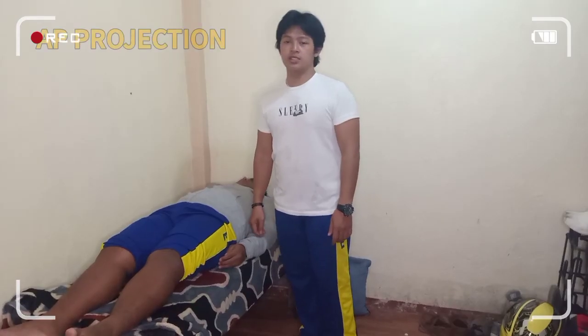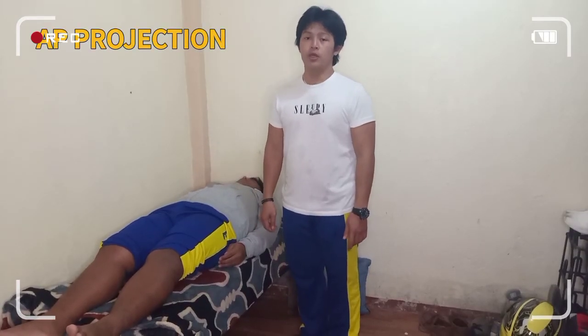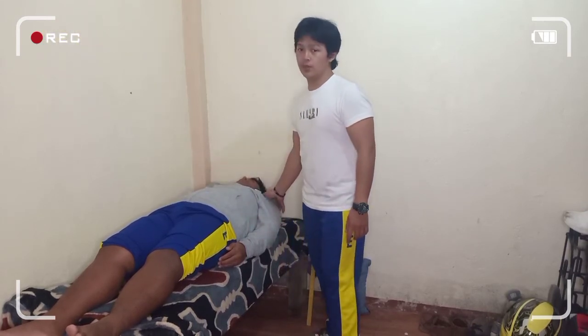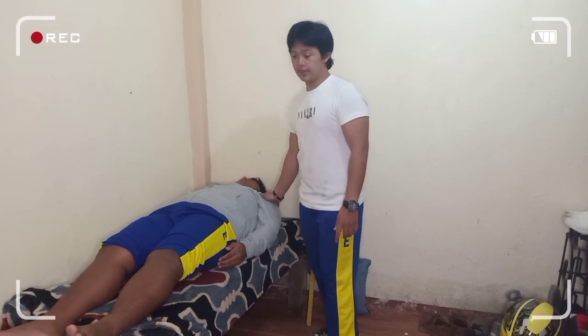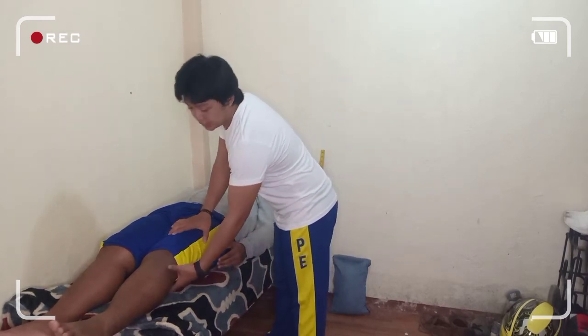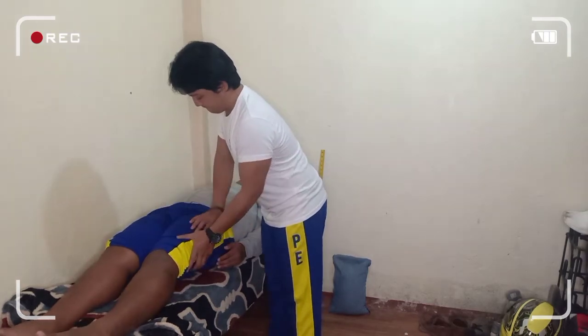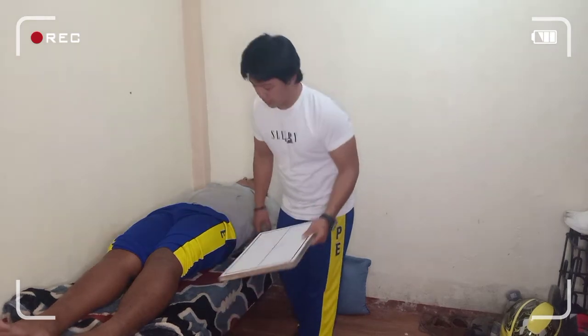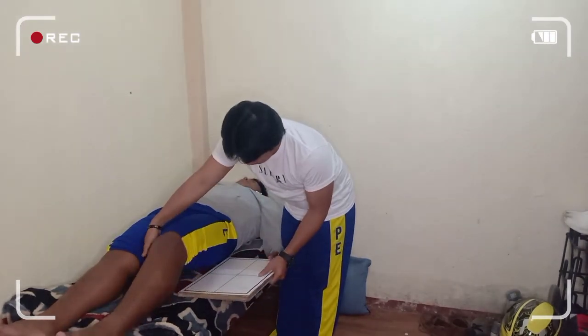Now, we will be discussing the different projections of the femur. Place the patient in supine position on the radiographic table and ensure that the pelvis is not rotated. Place the IR to the mid of the femur.